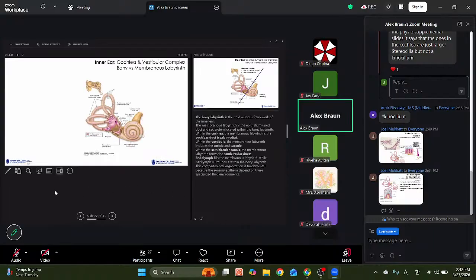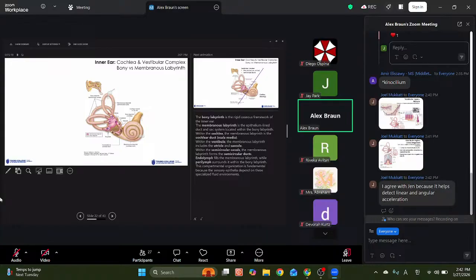Here's the inner ear, and it's a complex structure, as we already looked at, and it consists of several different elements. I won't go over them again in the same detail, but when you look at this, certainly you see the hearing apparatus, the auditory apparatus consisting of the cochlea, and you have the vestibular apparatus, that part of the inner ear which is responsible for assessing circular acceleration, linear acceleration, and the head's orientation with respect to gravity.